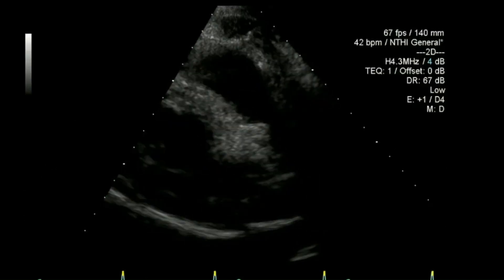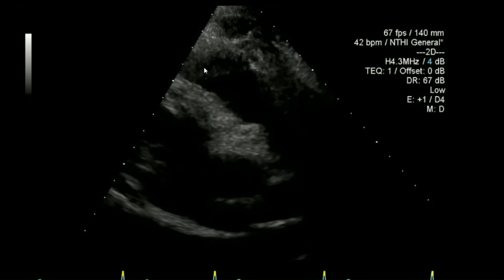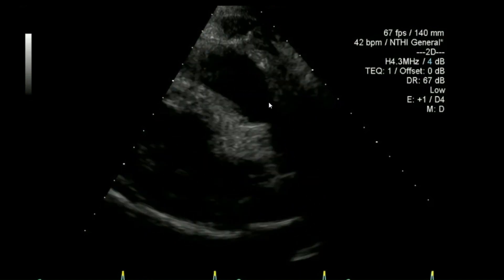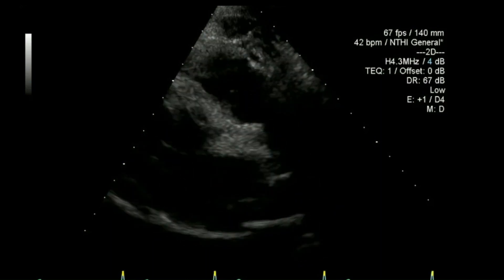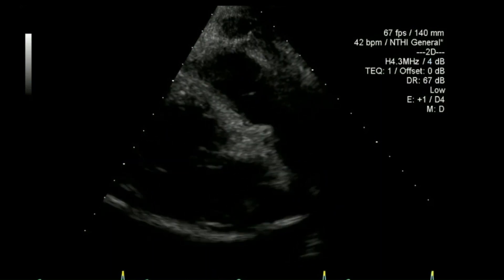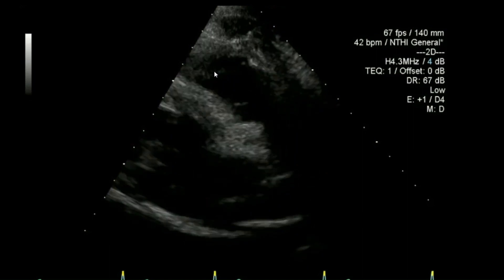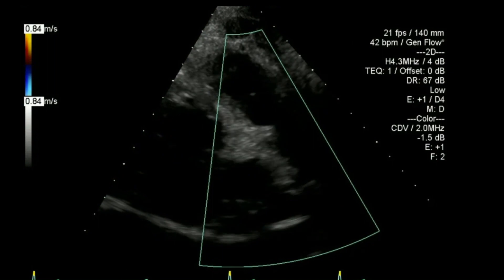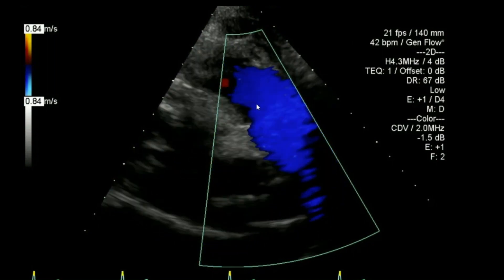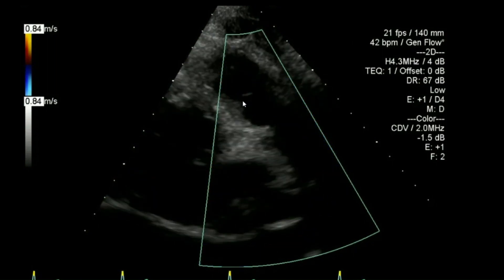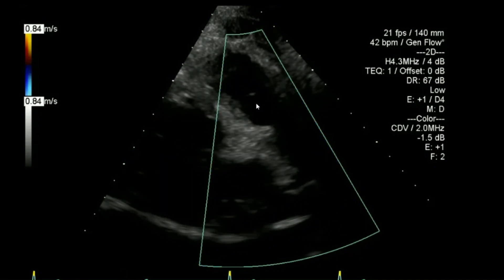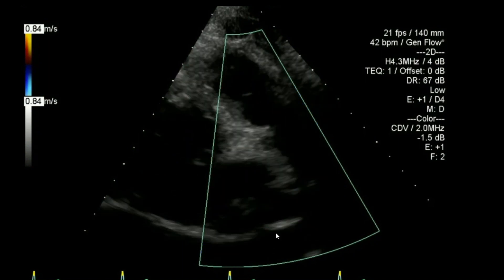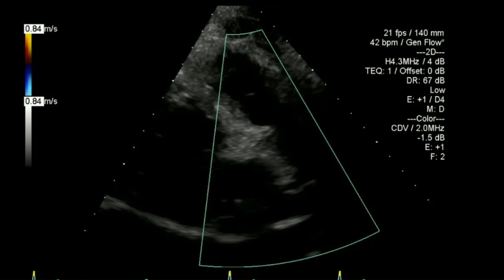Now I'm looking at the RV outflow view where I will try to maximise showing as much of the right ventricular outflow tract, the pulmonary valve, and as much of the main pulmonary artery down to the bifurcation as can be seen. Sometimes seeing these structures may need more than one image. I also want a colour flow that goes all the way down so I can see flow acceleration at any level, pulmonary regurgitation, PDA flow, or flow acceleration through the proximal left or right pulmonary arteries.